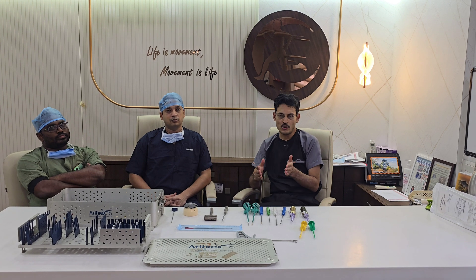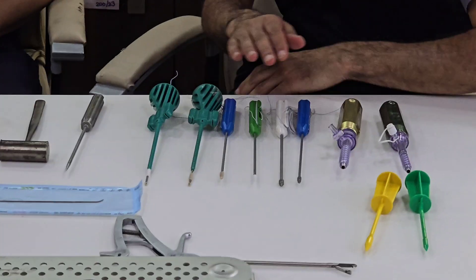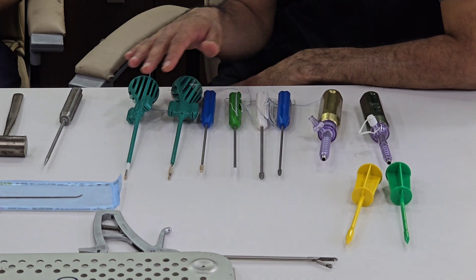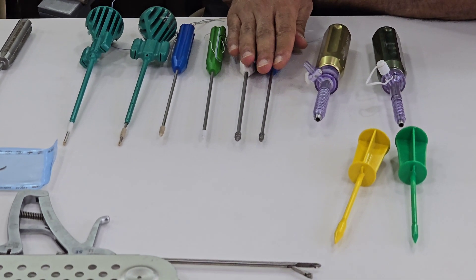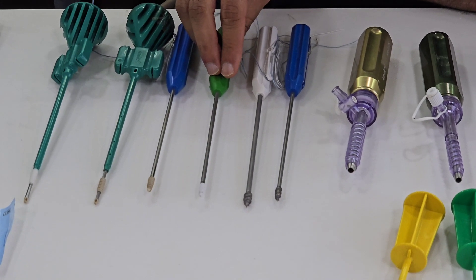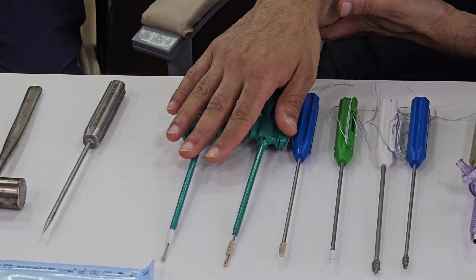If you focus on the anchors, Arthrax has a very wide range of anchors, ranging from metallic anchors to biocomposite anchors to PEEK anchors, and they also have knotless options available as well.